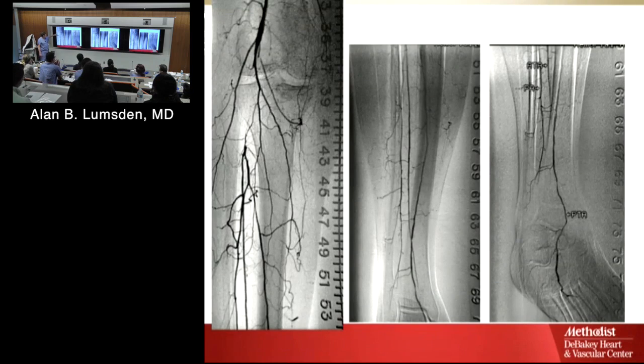Oh no, what about this thing? That's still the popliteal. Yeah, that's pretty hard to know. It probably is still the popliteal. There's none of the typical branching patterns. It just may be the angle, actually. That may be the AT. See how confusing it can become because they're all superimposed on top of one another.